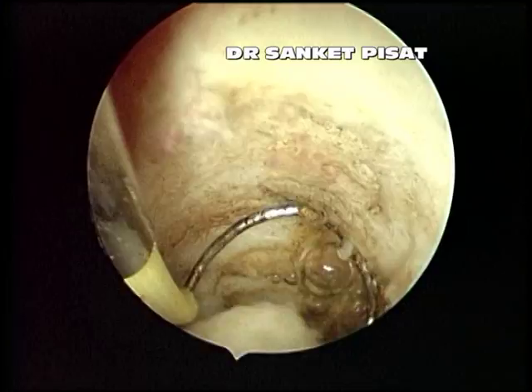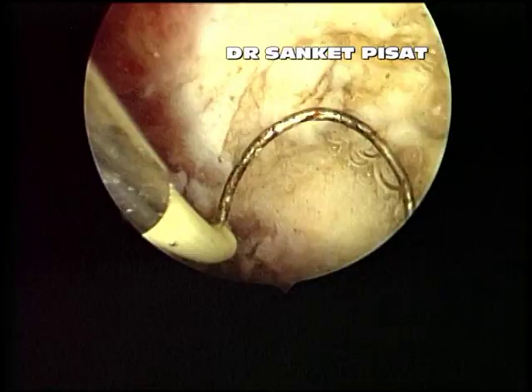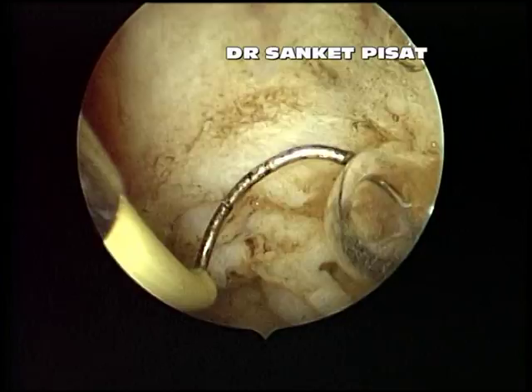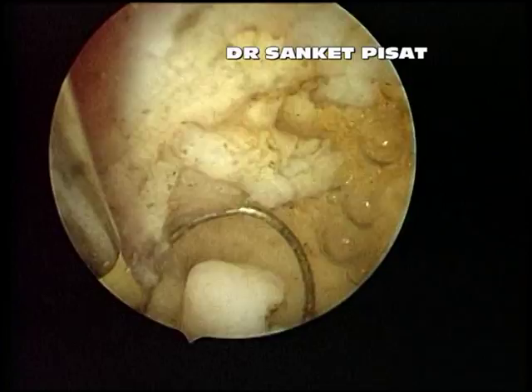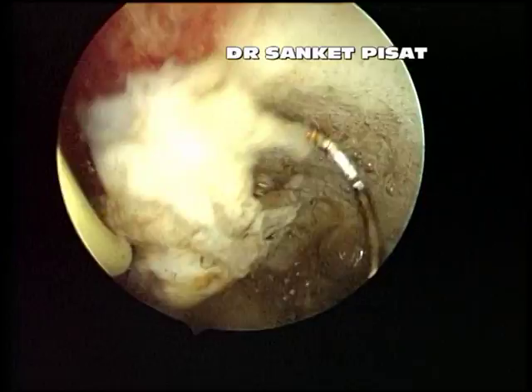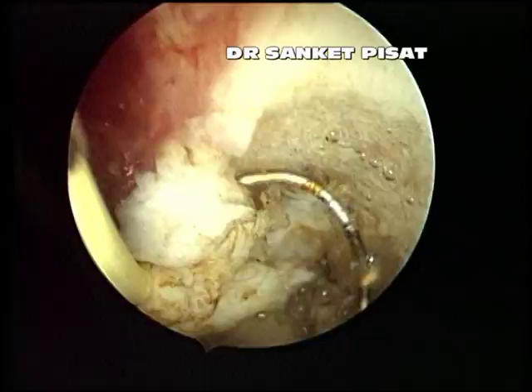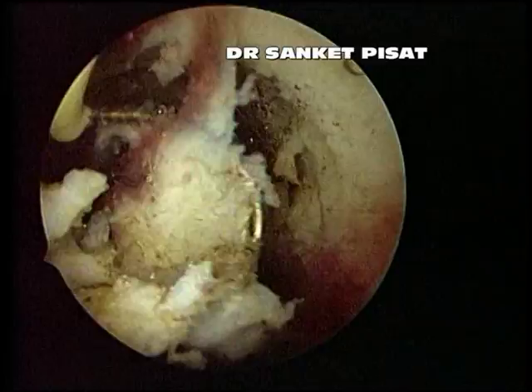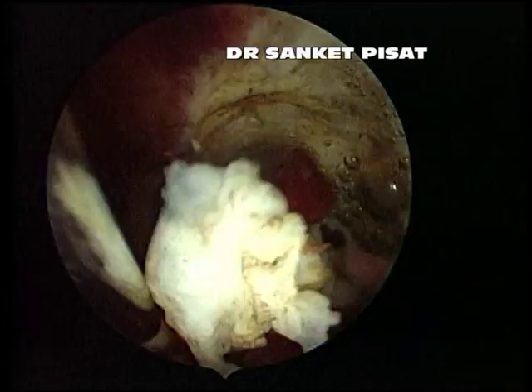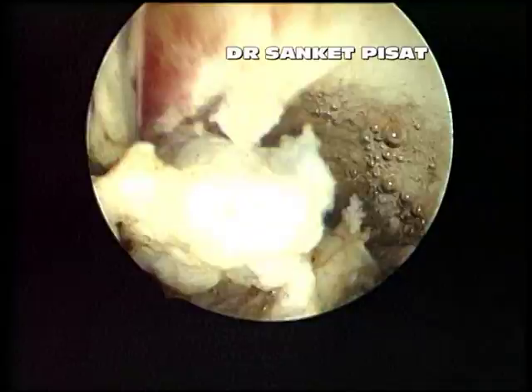Note that conventional myoma resection must always have the activated electrode moving away from the fundus of the uterus and towards the surgeon. The pushing movement towards the fundus must be done without activating the electrode, or by activating it in very short bursts only to release the restraining fibres. It must be specifically emphasized that these maneuvers can only be attempted once the surgeon has mastered the conventional resection technique. The beginner must fully understand that activating an electrode and pushing it towards the fundus will lead to perforation of the uterus. Also, the current may be transmitted to adjacent abdominal organs like the intestines or the urinary bladder, and therefore utmost care is needed in order to avoid perforation.